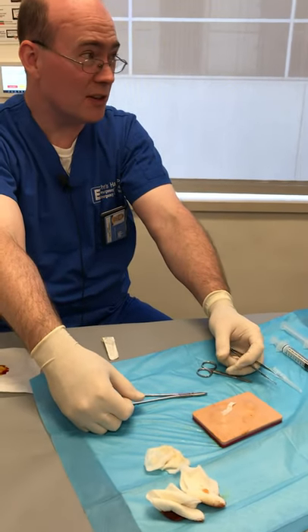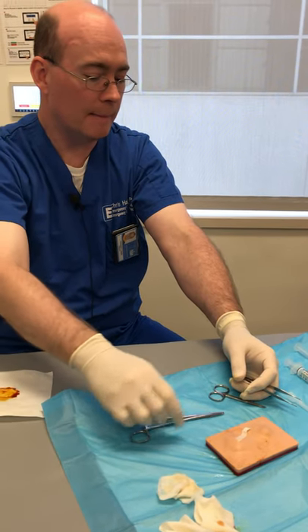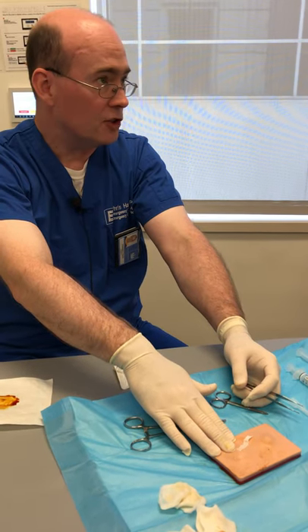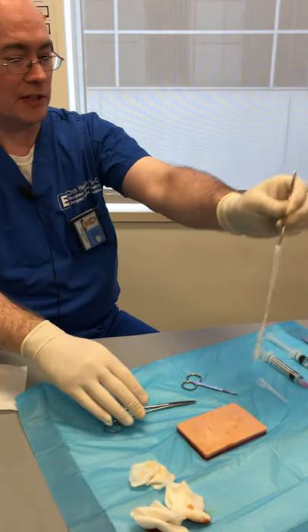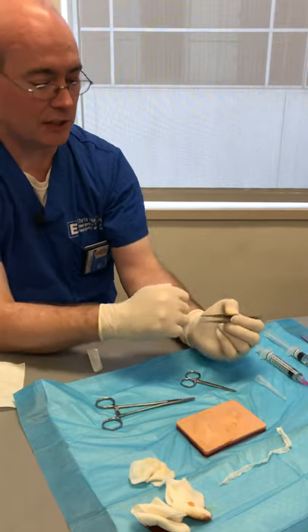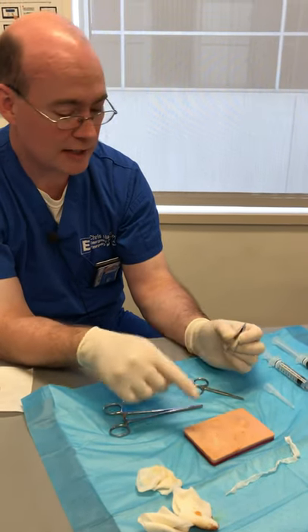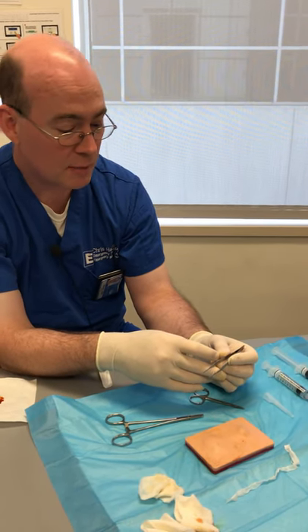If you have an abscess with cellulitis around it, they'll usually need antibiotics — and commonly these will be MRSA, so you have to use things like Bactrim to cover it. For packing changes, it's basically the same process: cut a sterile strip of packing about the same length, take out the old packing, and repack it. Depending on how it's healing, you might need to repack it two or three times over a week or ten days. Then usually the edges kind of heal up and you don't have to worry about it sealing back together.